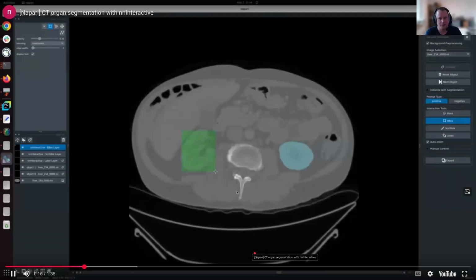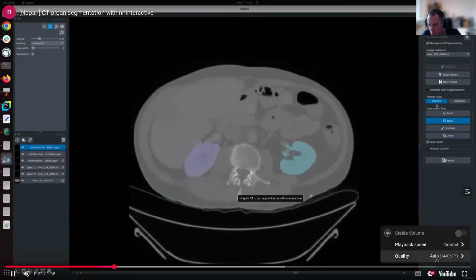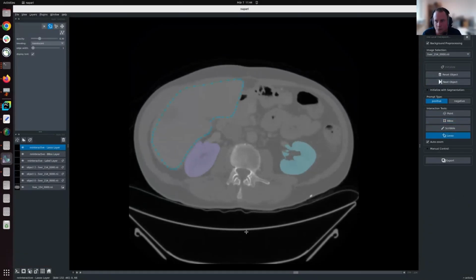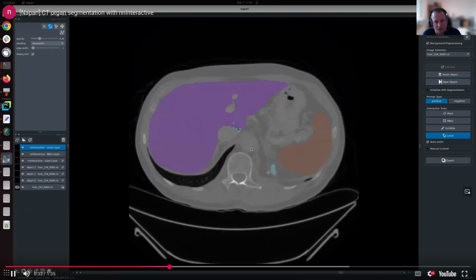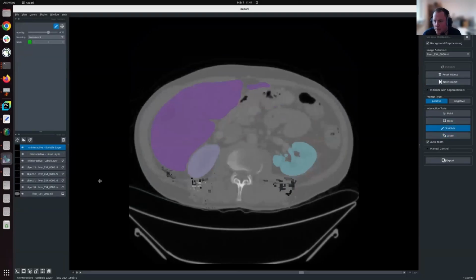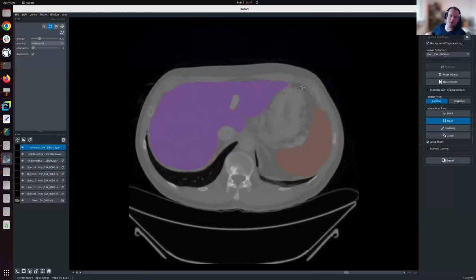Yeah, so I think with nnInteractive, we've actually managed to achieve all of these things. Please excuse the low resolution of the video. I'm fixing that right now. So here you see me interacting with nnInteractive in the Napari imaging viewer, and you're seeing also me make corrections. So here you see there was something missing in the segmentation, and it really nicely responds to additional prompts. And you see me use all these different prompting styles in different orderings and in different ways. And what you're seeing here as well is me segmenting first the liver, and then in a dedicated segmentation layer, I was segmenting the tumor.